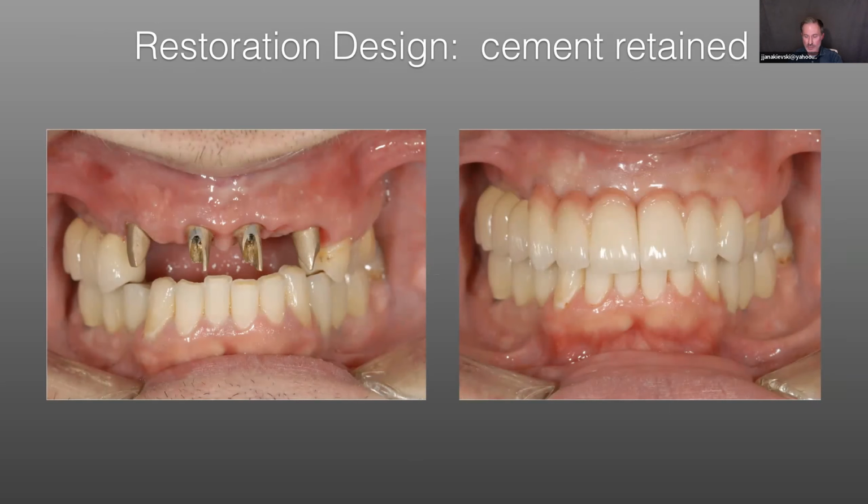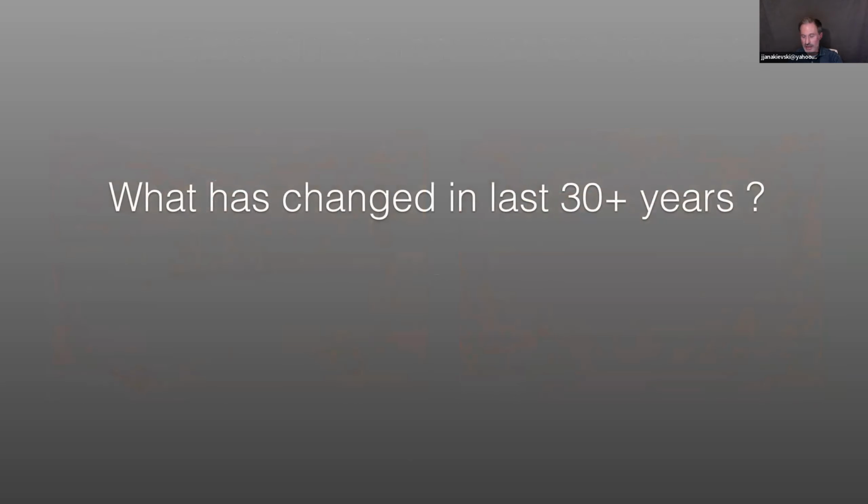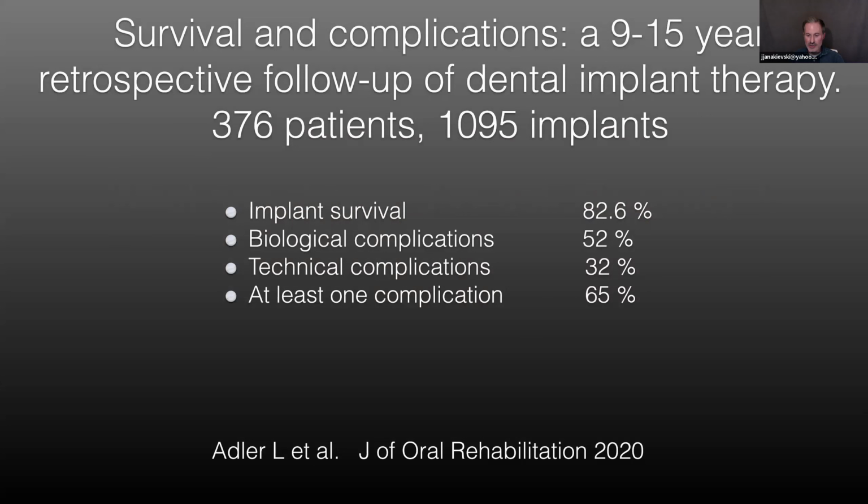What we realized over the past 30 plus years, since the original conference in Toronto, is that we've been through these phases, and now, looking back at our experience in implant dentistry, we realize that it's not as straightforward as we thought it would be. We're dealing with a lot of complications, be they biological or technical, which may require us to remove the prosthesis and service it.